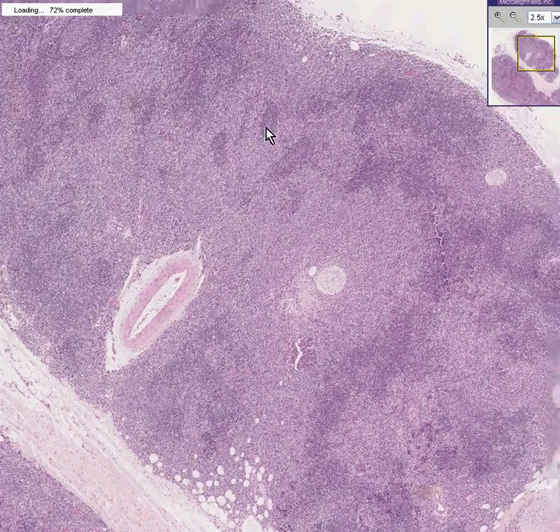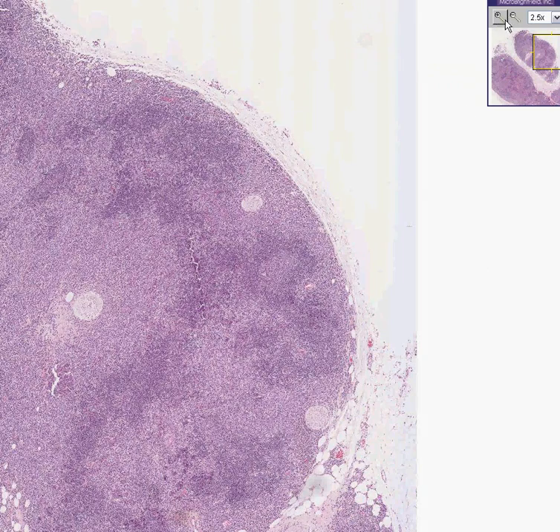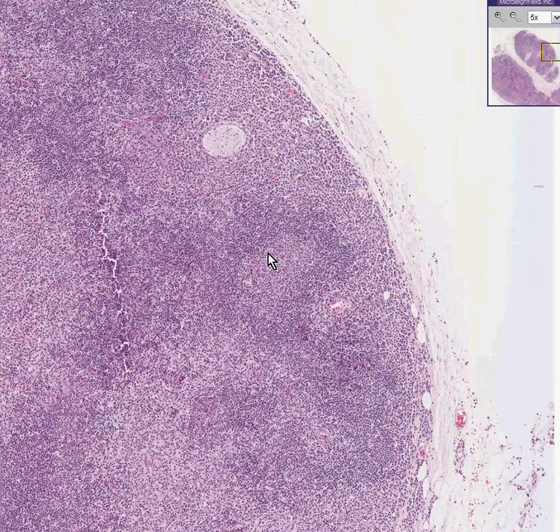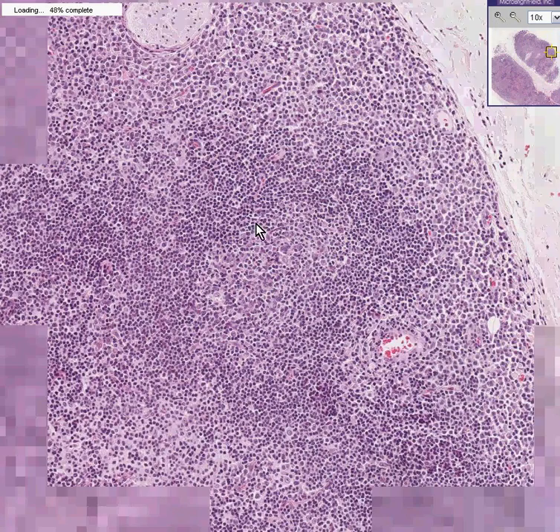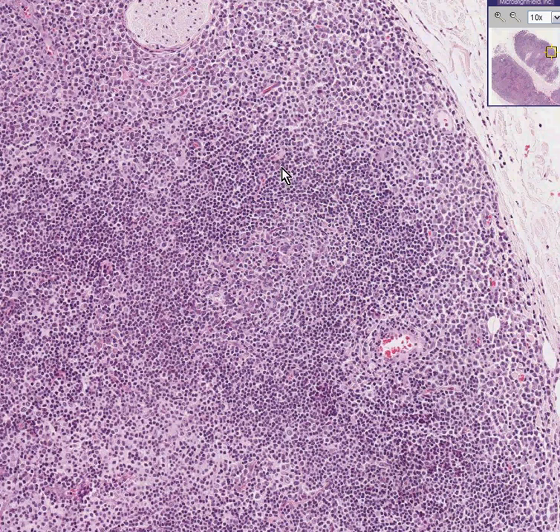I'll try to find a normal germinal center. There's one here, probably here, and this looks pretty nice too. The germinal center is a lighter area surrounded by a darker cuff of smaller lymphocytes. The immediate zone of B lymphocytes surrounding the germinal center is called a mantle zone. The layers of lymphocytes after that is called a marginal zone of B lymphocytes.